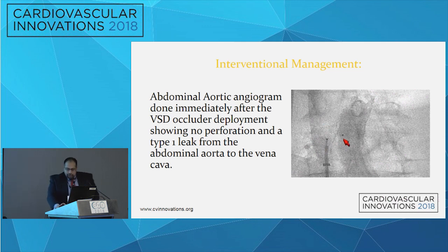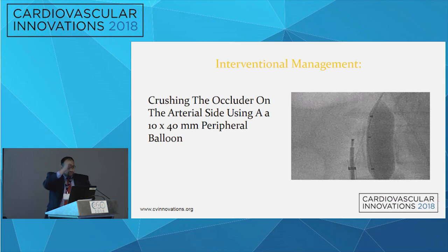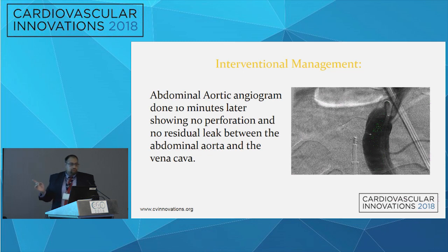Given all the calcium around this, we decided to balloon this and crush the disc on the arterial side, because we wanted that disc to be very well apposed to the arterial side. We waited 10 minutes after that. We got very good results on closure, as you can see, and there was no residual flow.